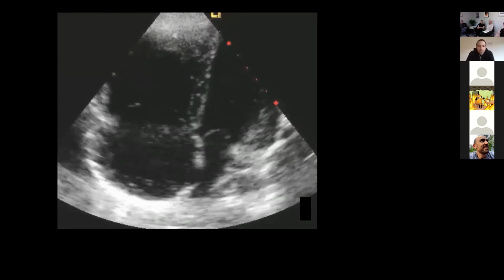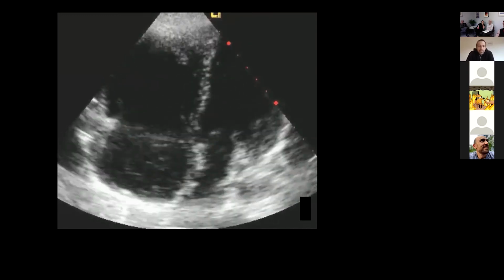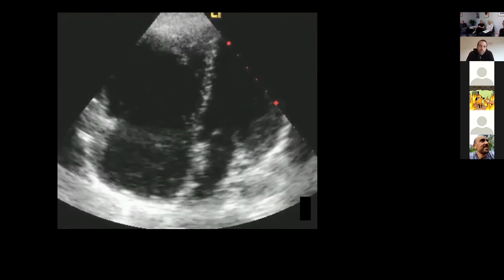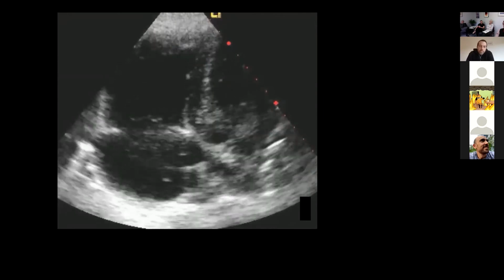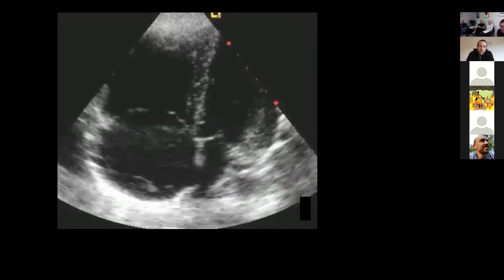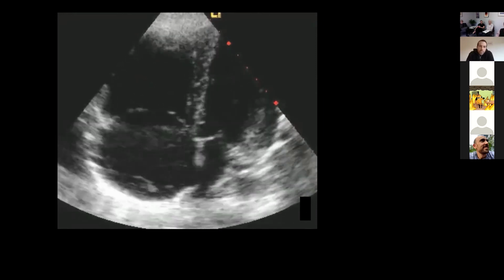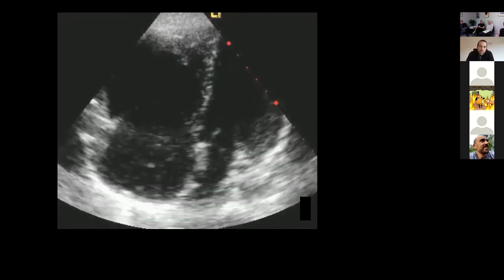This is her picture from the apical 4 chamber, obviously done during CPR as best we could. And this is the classical picture of a woman that halfway through a cesarean goes from being entirely stable to being completely unstable. She has an amniotic fluid embolus. It's hard to prove, but it seems to us that those floating white masses may be the embolus as opposed to bubbles of saline from injections, but it's hard to tell.